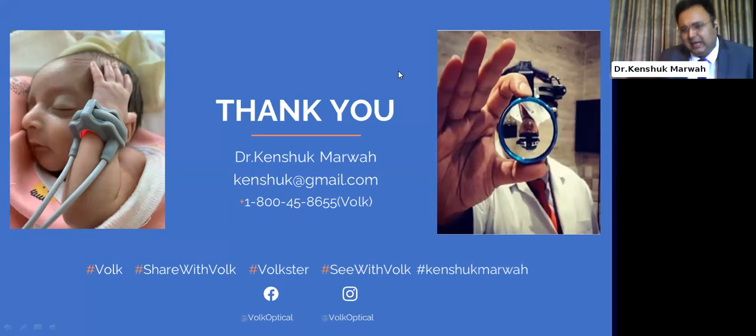You see how those lenses work, and the first preference would be in the slit lamp 90D, and for gonioscopy, go in for a four mirror non-flange lens.